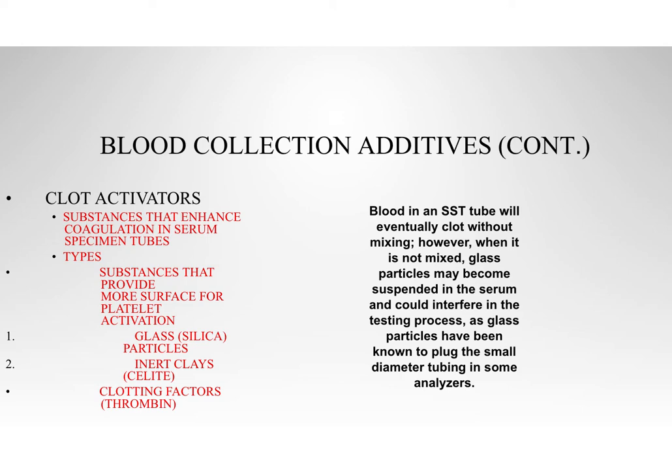Basically, if you don't mix those tubes well, because you're like, oh, the blood clots anyway, so I don't really have to mix it, and you don't put as high priority on mixing it as you do whole blood, those little glass particles are not going to be coated in the clotting factors, in the platelets, and things like that, like it is supposed to, basically. And it can mess up the analyzers and cause you to have to do another stick too, probably. So make sure you put priority on mixing all of your tubes, no matter what is in the tube, okay?